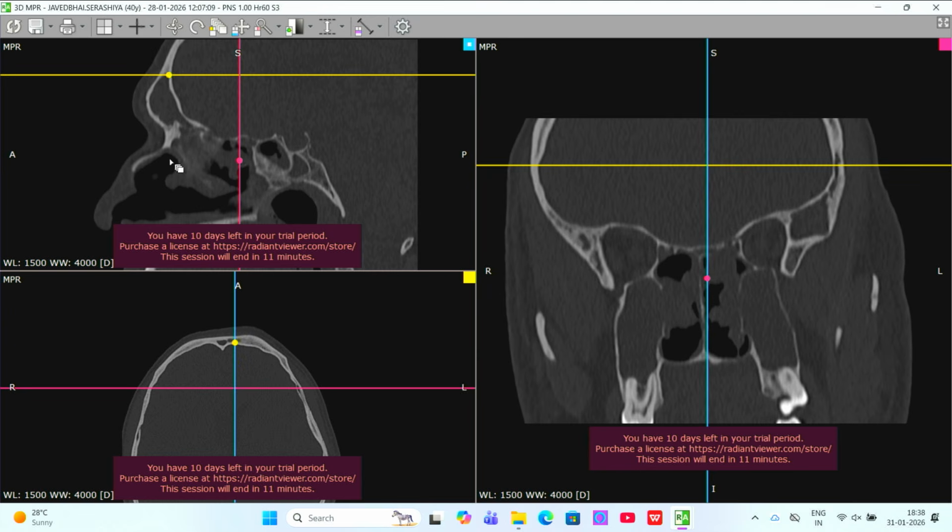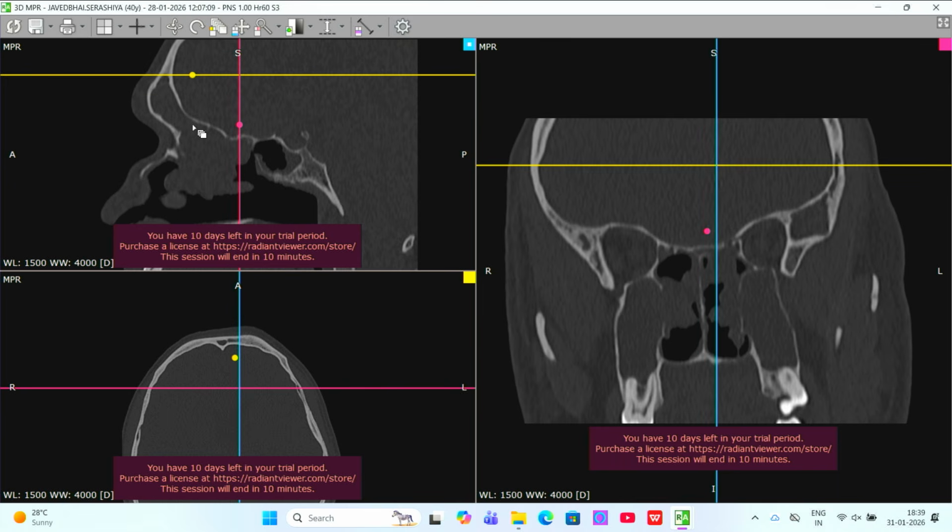See, this beak is the key. Identifying and dealing with the frontal sinus is complicated only and only by this beak. And the beak is fortunately a landmark which you can easily identify. This is the thickest bone in this region. With the endoscope, with 70 degree, you follow the beak to where the beak ends in the frontal sinus. As simple as that. See this? Where the beak ends is the frontal. You don't need any other landmark for the frontal sinus. Believe me, after seeing this, you will realize the frontal is the easiest sinus to open and go inside.